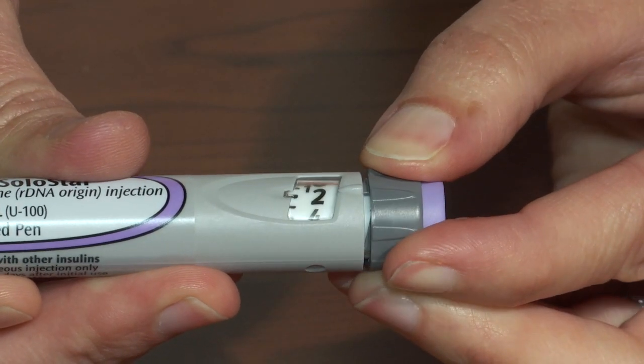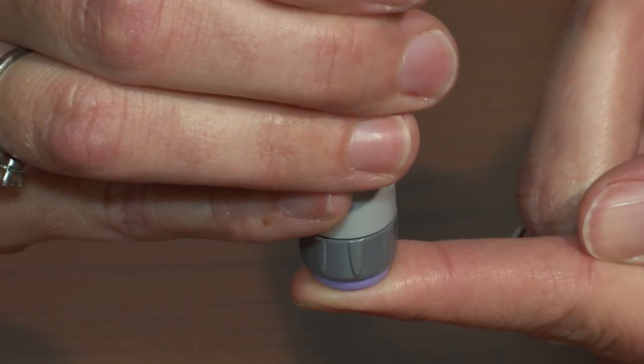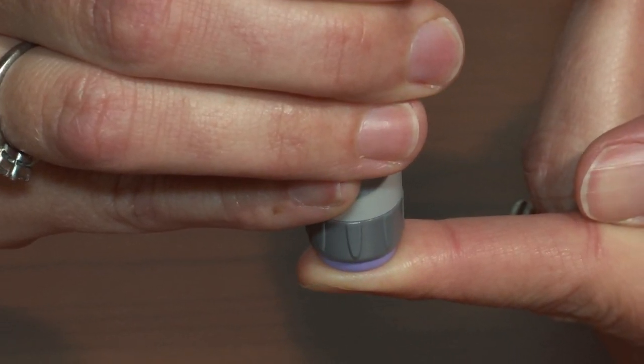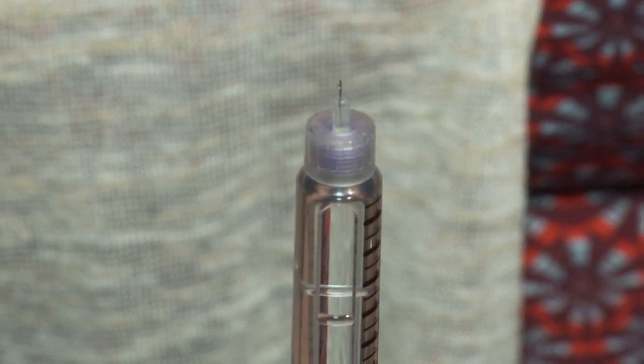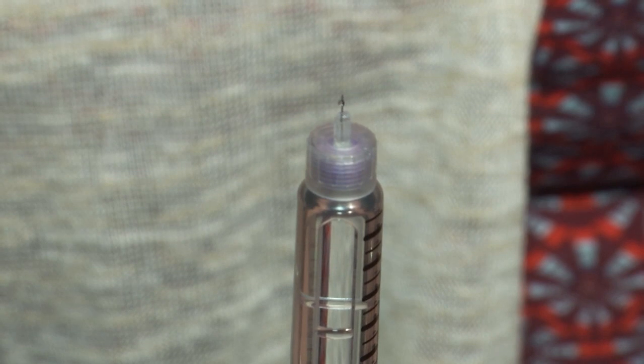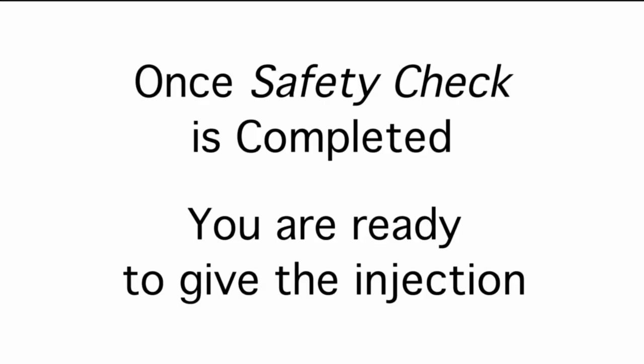You are now ready to perform the safety check. Dial the pen to two units, point the pen needle up toward the ceiling, and push the injection button on the pen device. Watch the tip of the pen needle and be sure you see a drop of insulin at the tip to ensure all components of the pen are working properly.